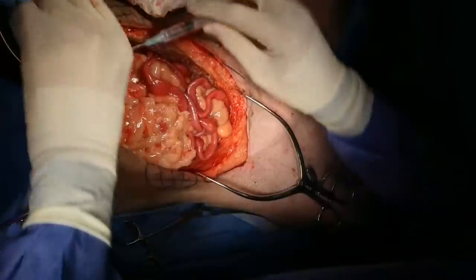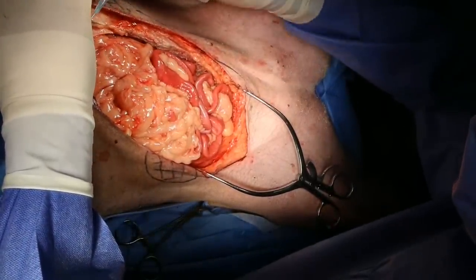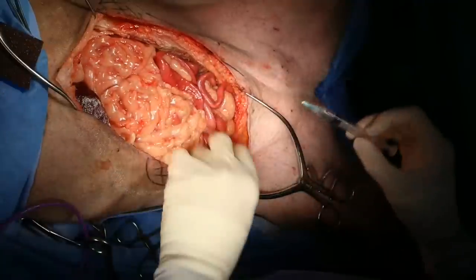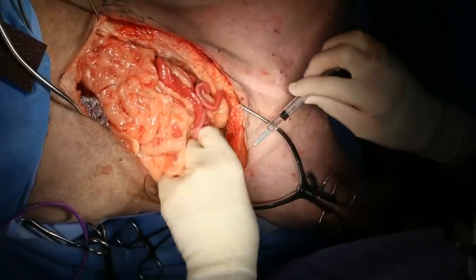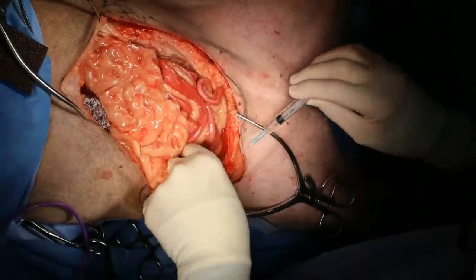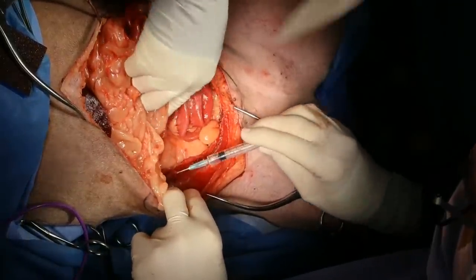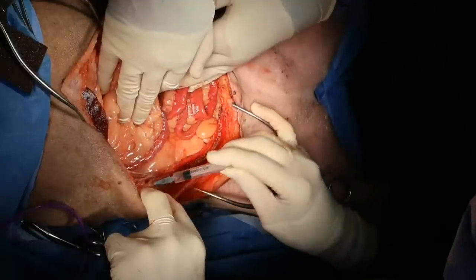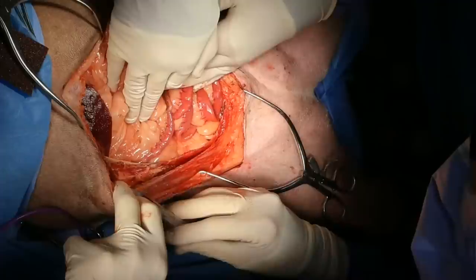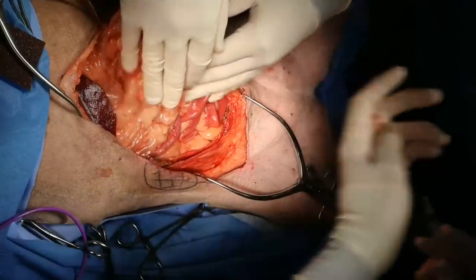There's nothing that works as well for pain relief as a local anesthetic. A sodium channel blocker is better than any opiate. Quite a bit, yeah. We'll be able to close the skin primarily.